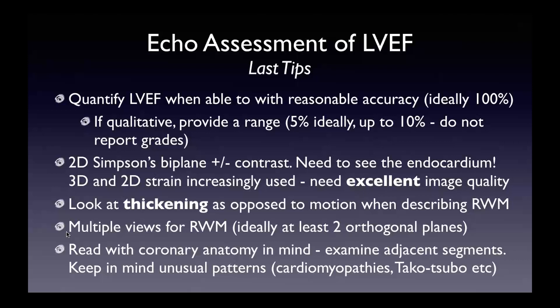We didn't talk much about regional wall motion, but regional wall motion assessment is one of the key aspects of looking at systolic function. Focus on thickening, look at multiple views — ideally at least two orthogonal views — to confirm the same wall motion abnormality. Read with coronary anatomy in mind, examine adjacent segments, and keep in mind unusual patterns such as Takotsubo cardiomyopathy. For example, if you see an apical wall motion abnormality, pay close attention to the anterior wall and anterior septum.